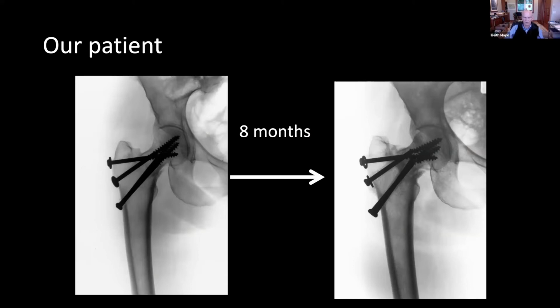You would look at the neck mismatch relative to the intertrochanteric line and say, well, in addition to some potential problems in the frontal plane, there may very well be a rotational deformity of this femoral neck. At any rate, she went on at 8 months to this position, painful, disabled, and extremely unhappy. So now we have to have a way of reproducibly getting to a successful plan for this patient.